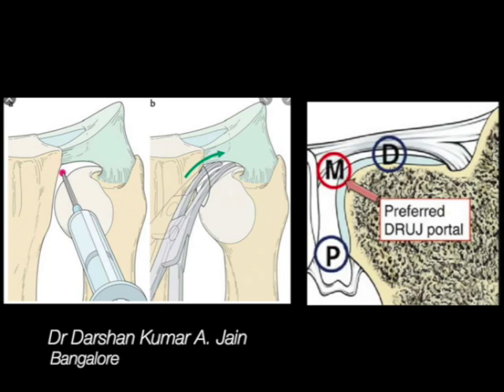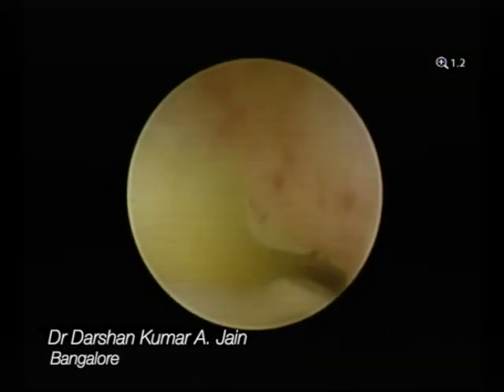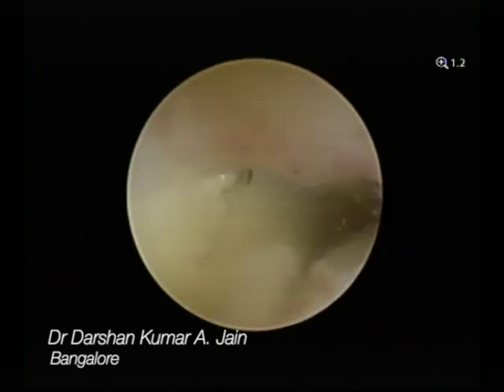This is how one approaches the distal radio ulnar joint. These are the portals — the proximal, distal, and the middle portal. We start viewing through the middle portal, the DRUJ portal.